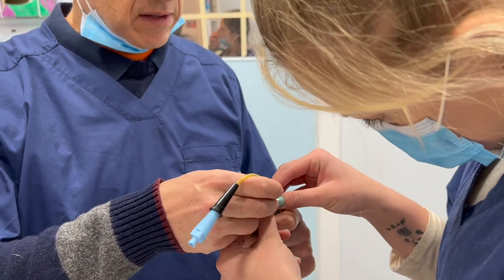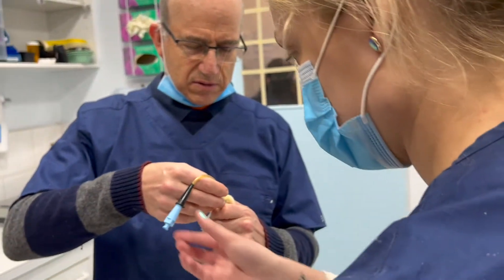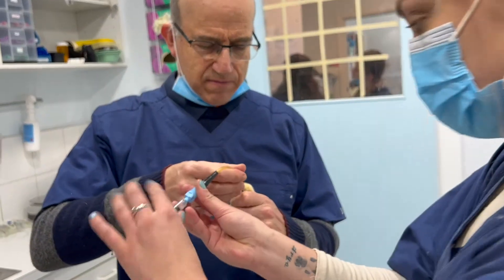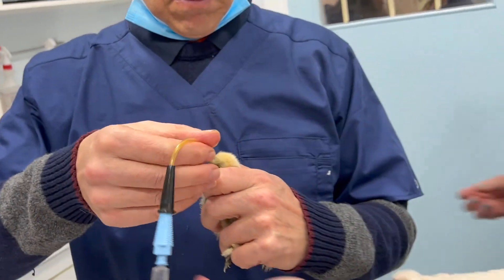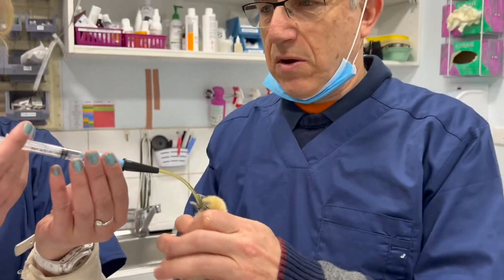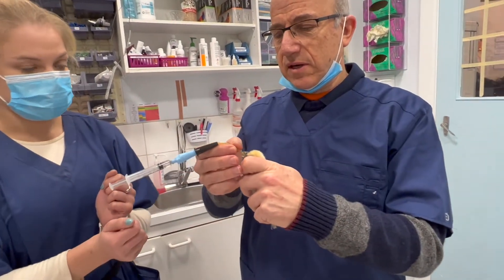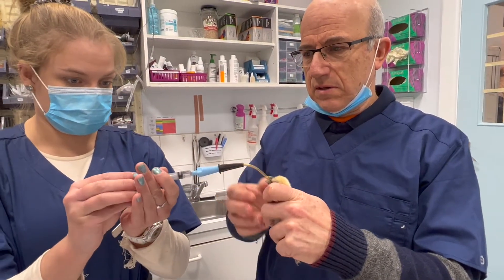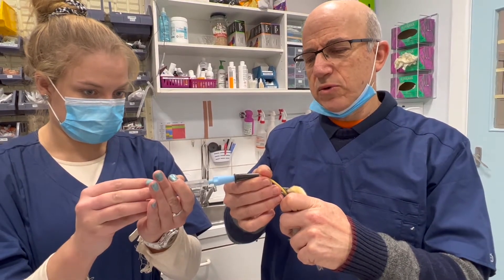Good job, honey. Okay, thanks. Why don't you put a syringe on the end here, please? I want you to — don't do anything until I do it. I'd like you to just try and suck out. Hold and suck. Try and see if you can suck anything out. Carry on, slow — not too much pressure.